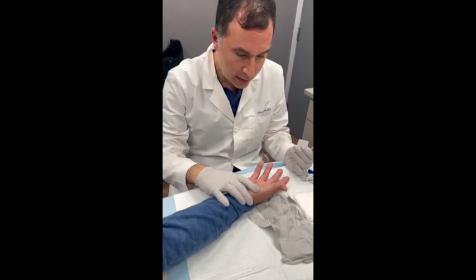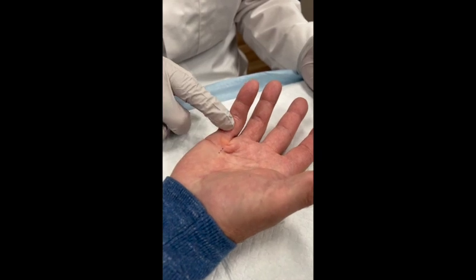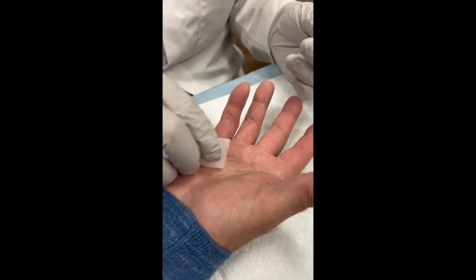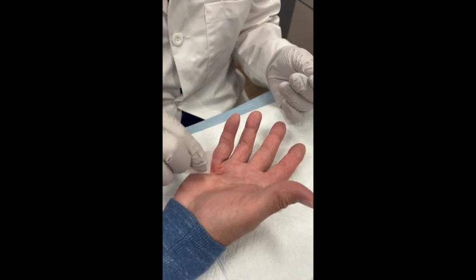I'm going to have you take a look at his hand, and you can see he has a contracture. I just put some markings where there's a palpable cord here. So what I'm going to do now with the medication is inject directly into the cord in three points.